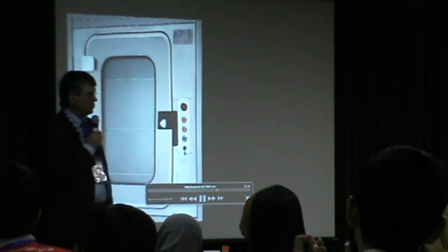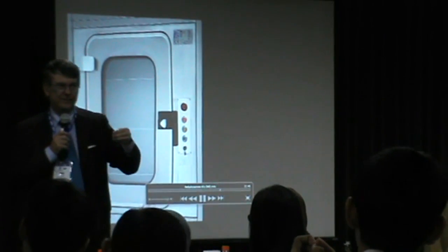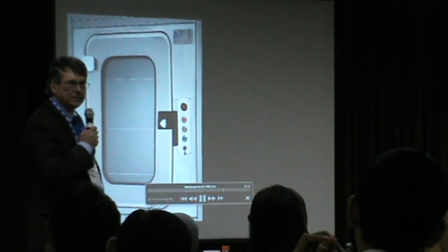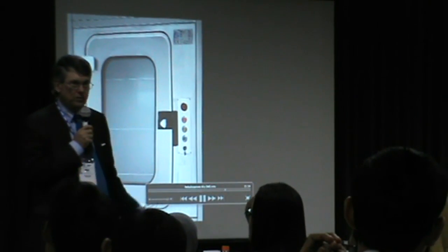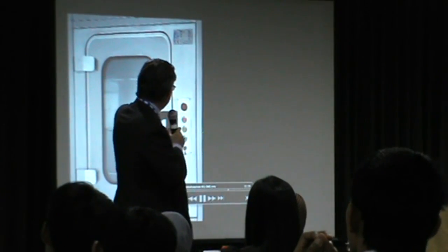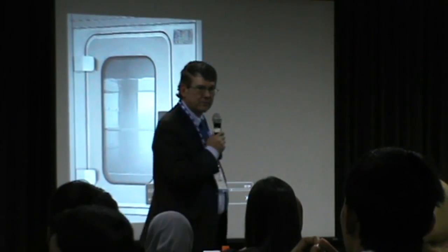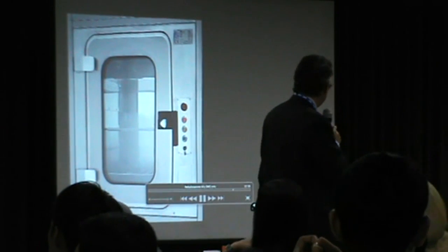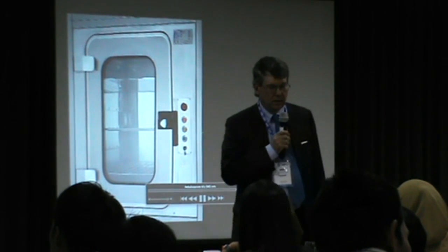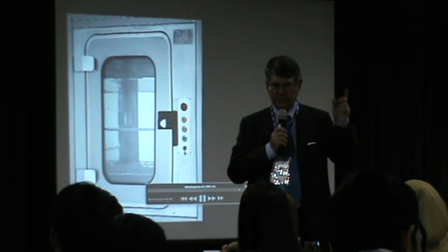You know, when you take a shower, you have a lot of condensation, a lot of water that goes down, and here there is no effect like this. So it means that this dry mist stays in the environment. And here you can see the aeration. So all this mist is taken out from the enclosure. So this is a static process, no mixing.